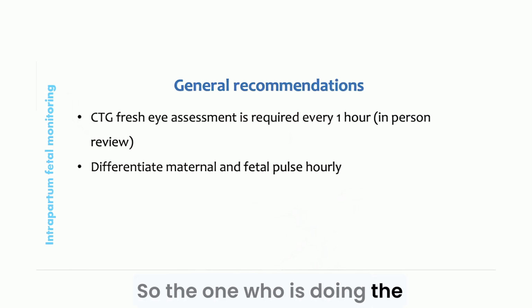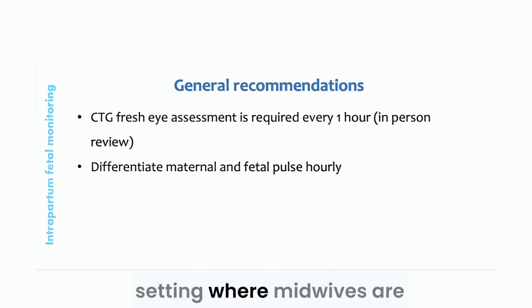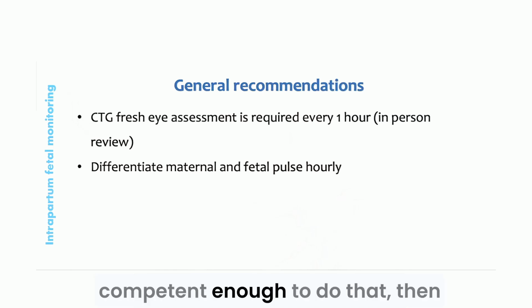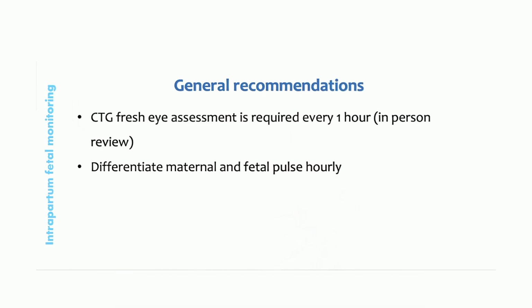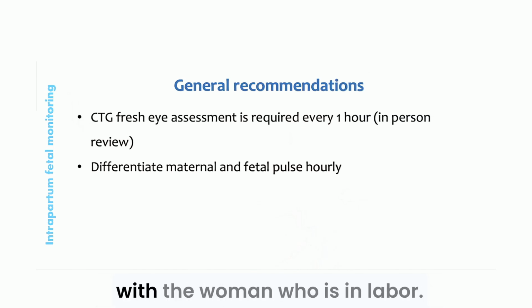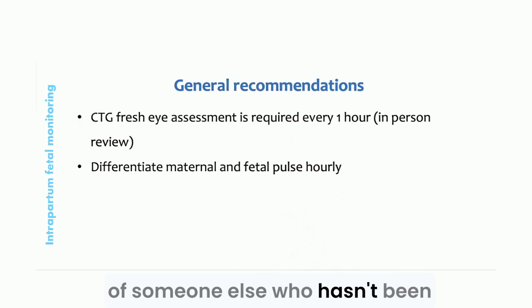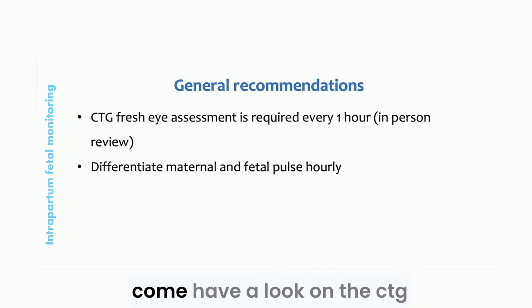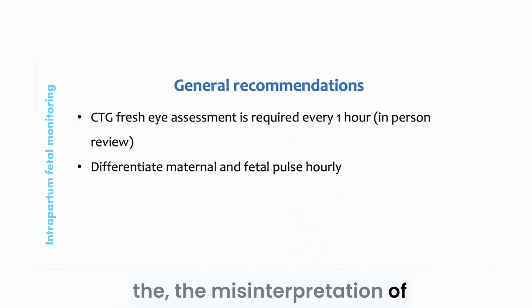So the one who is doing the interpretation of the CTG, sometimes if you're working in a setting where midwives are competent enough to do that, then they do it. But you still need the midwife in charge, the one doing the one-to-one care with the woman who is in labor. She should be the one doing the continuous assessment of the CTG, but you just need a fresh eye of someone else who hasn't been in the care of this patient to come have a look on the CTG, because that helps to minimize the misinterpretation of the CTG.